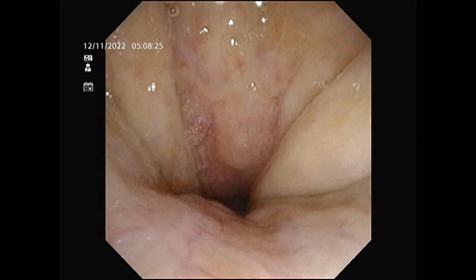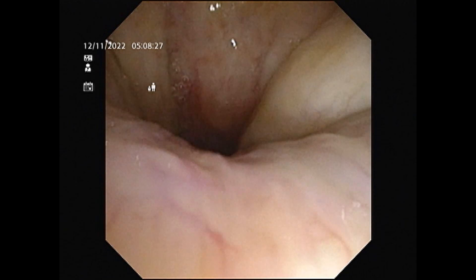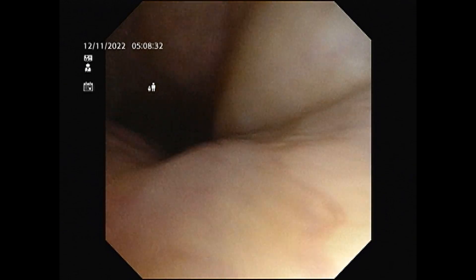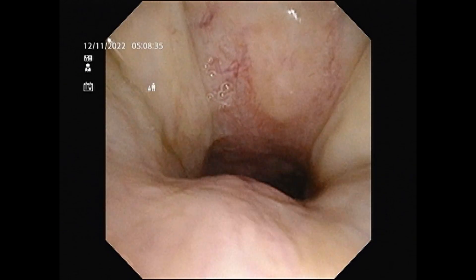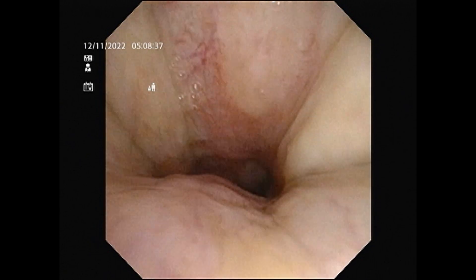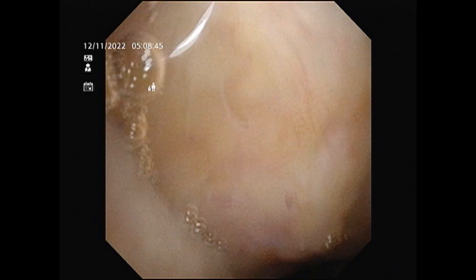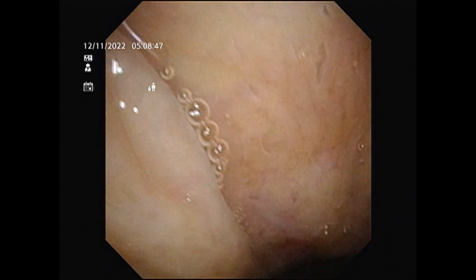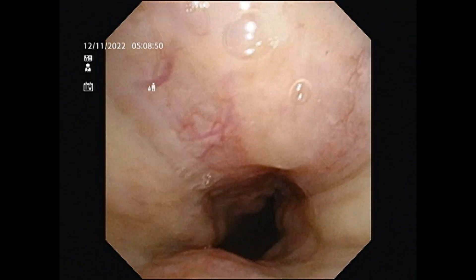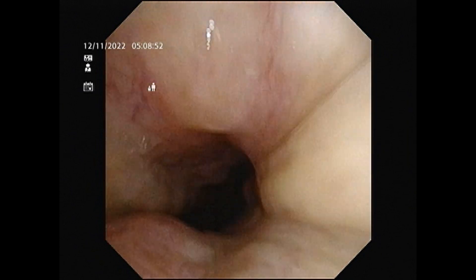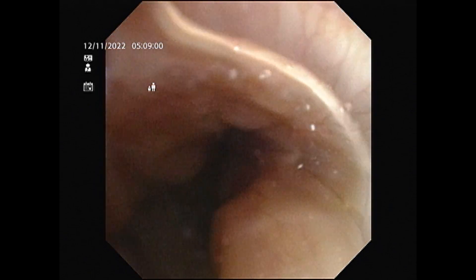This is at the level of the soft palate — the area between the patient's nose and the oral cavity. If you happen to look at this area from your mouth in a mirror, you will see a structure hanging off the roof called the uvula. But we are viewing from a superior direction from the nose, so it looks like this. You can see it trying to open up and narrow down, depending upon the phase of sleep the person is currently in.